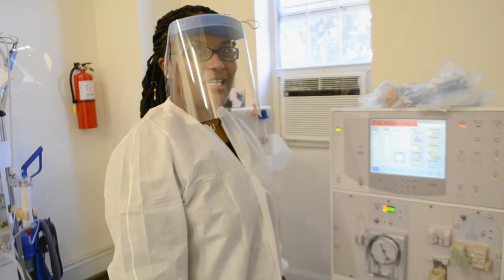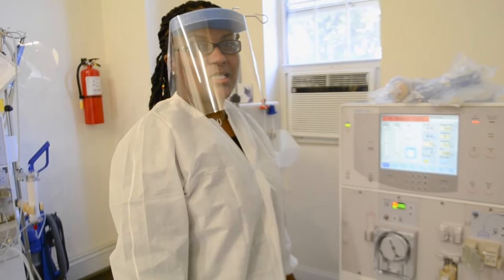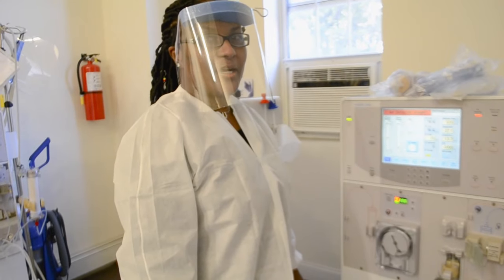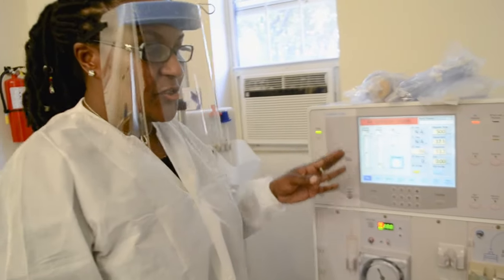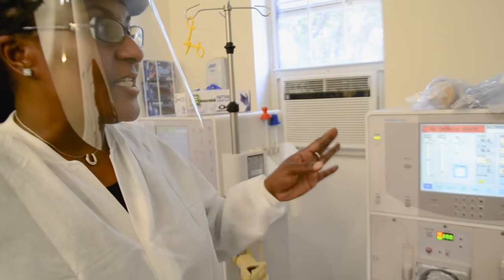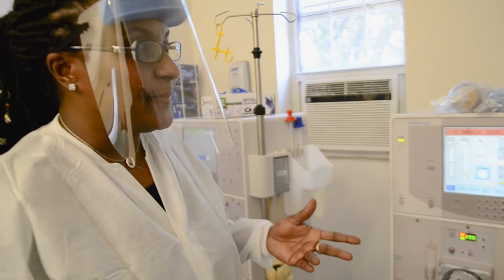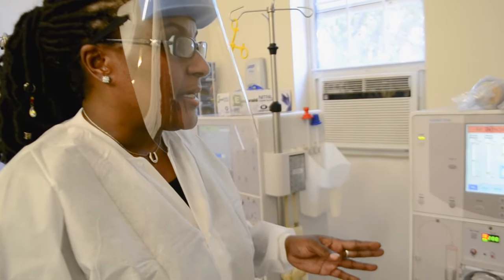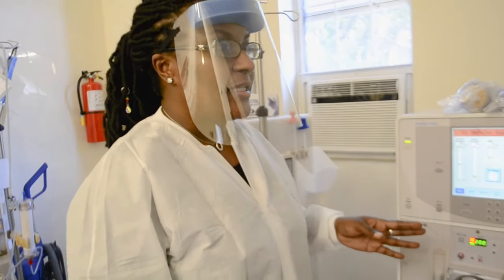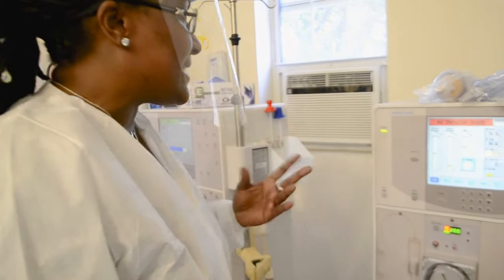Hello everyone, I'm Ms. Taylor from Dialysis Training Institute of Excellence, and today we're going to do machine setup part one. That's actually going to take you through putting the lines on the machine and recirculating. As I go along through the steps, I'll explain everything that you need to do and also in the order in which you need to do so. Let's get started.